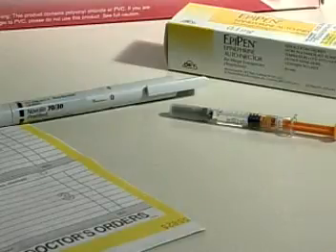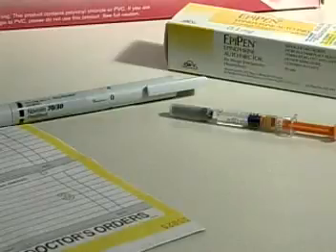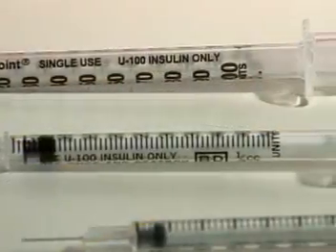Medications may come as prepared syringes for subcutaneous administration. Examples are anticoagulants, insulin, and epinephrine. An insulin syringe is calibrated in units.